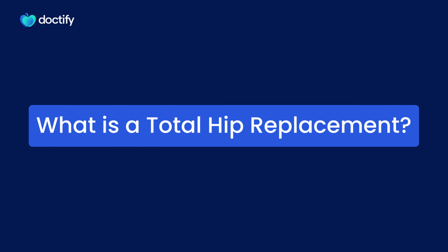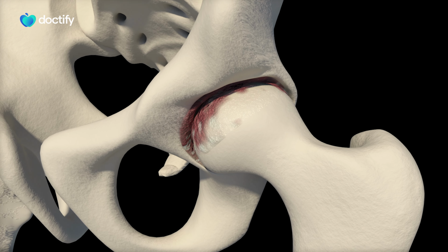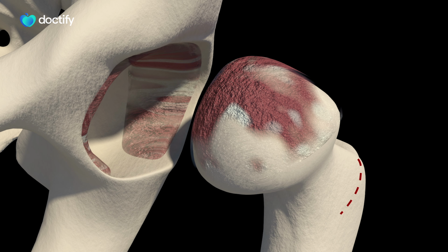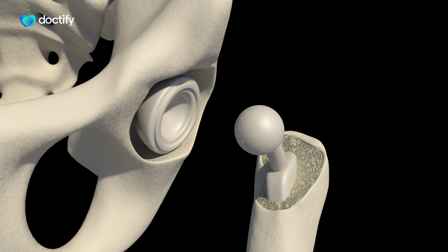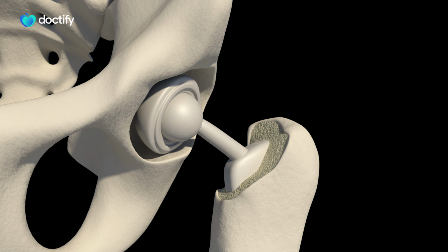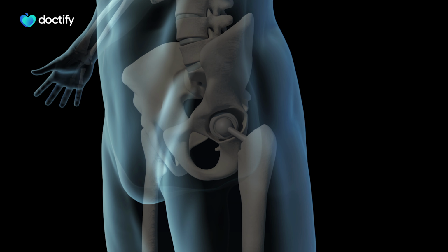So, first of all, let's discuss what is a total hip replacement. Total hip replacement is essentially an artificial joint that replaces a native hip joint. And this is commonly done for patients who have arthritis, osteoarthritis being the most common. It can be done for other conditions like inflammatory arthritis, like rheumatoid arthritis, following previous fracture, etc. And there are some rare conditions when a hip replacement is done.